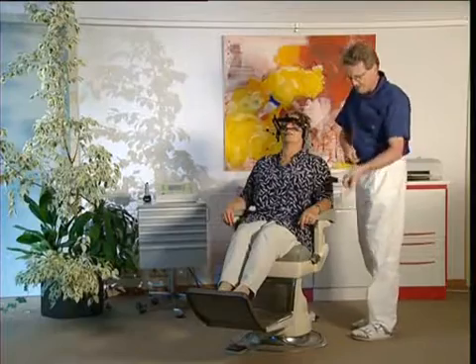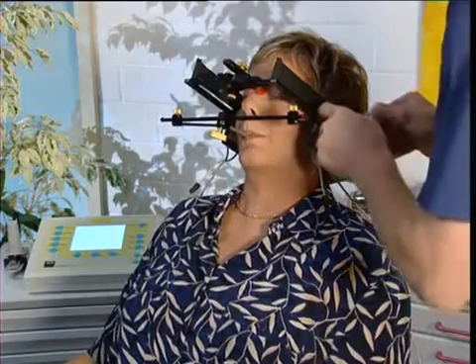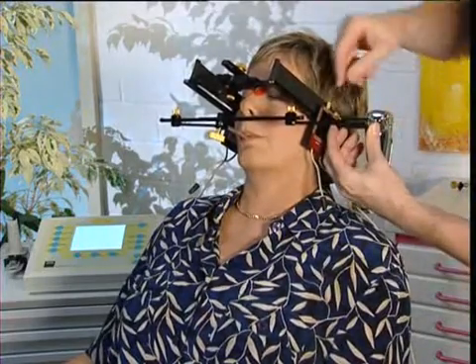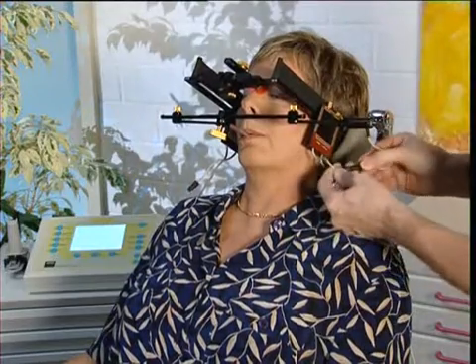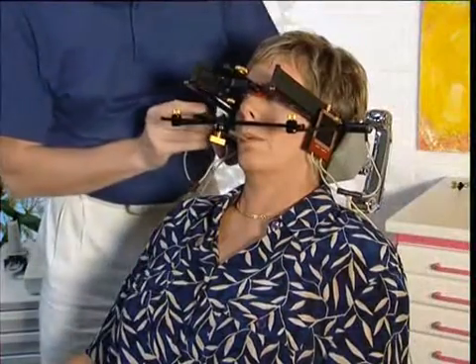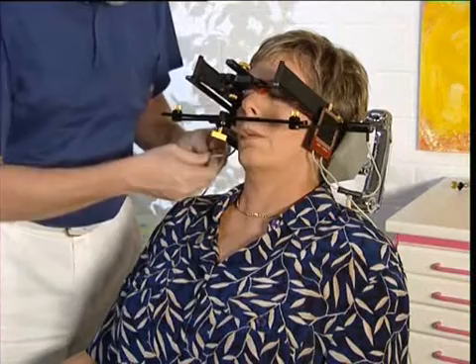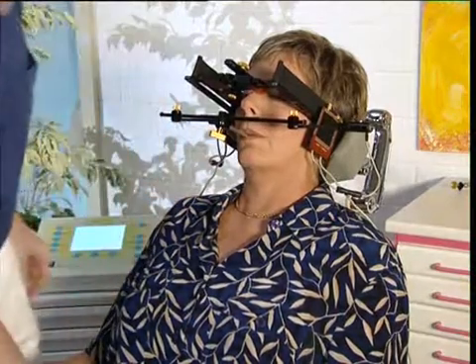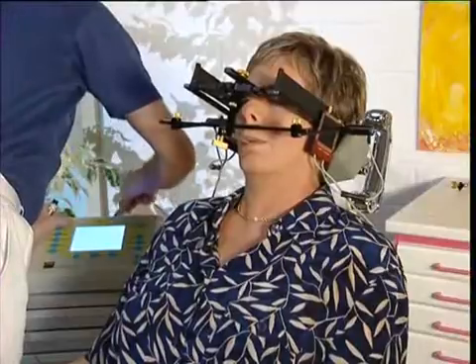The patient should hold the plug of the left tracing sheet in the left hand and the right plug in the right hand to prevent them from being crossed over while being connected to the electronics box. The electronic styluses are pressed into the sockets in the side arms and screwed into place. The stylus and tracing sheet cables are then plugged together. The cables must be connected to the correct sides of the electronics box.